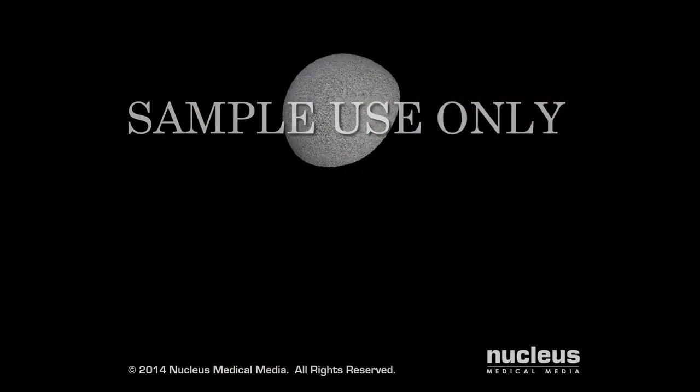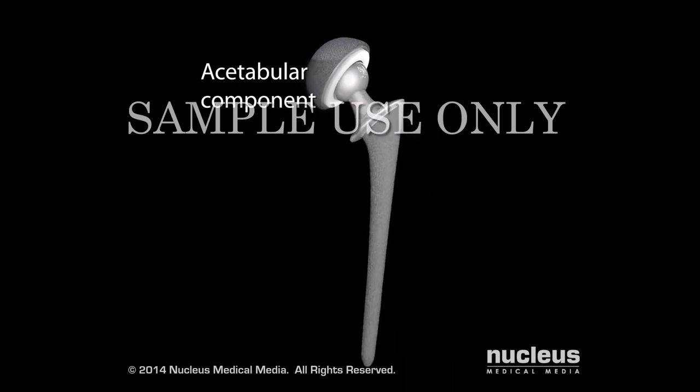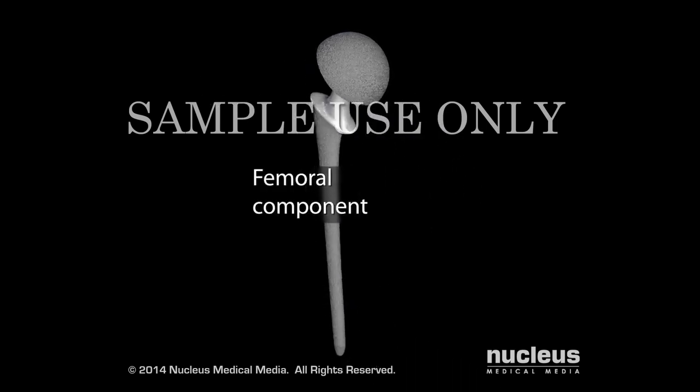An artificial hip prosthesis consists of a cup called the acetabular component and a stem and ball called the femoral component.